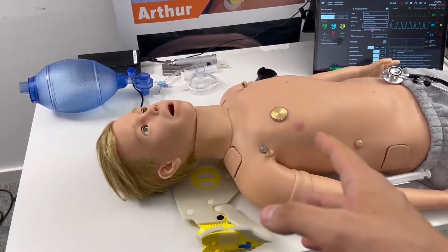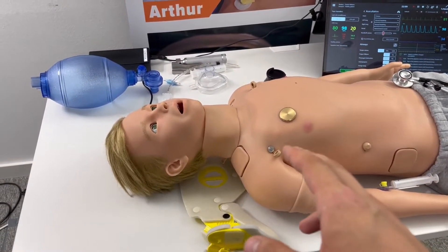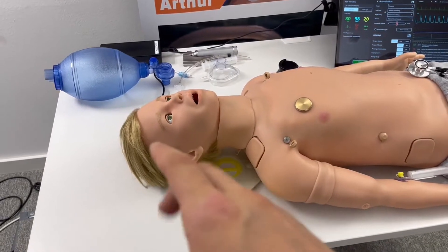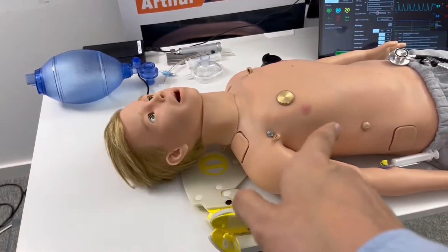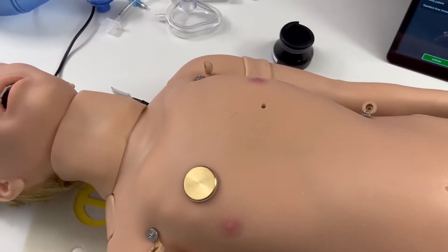The internal anatomy of Arthur has been upgraded so that when you're using the nasogastric probe, the anatomical structure allows you to go deeper, as you would in real life.